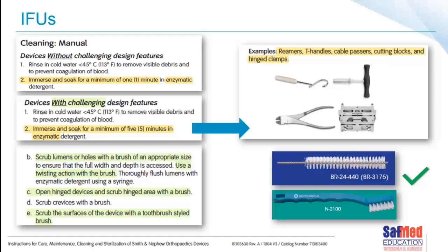If you have an outbreak of infection, the lawyer is going to ask, did you follow the instructions for use? That's the first starting point. And the question is, do you actually have them? Have you ever read them?